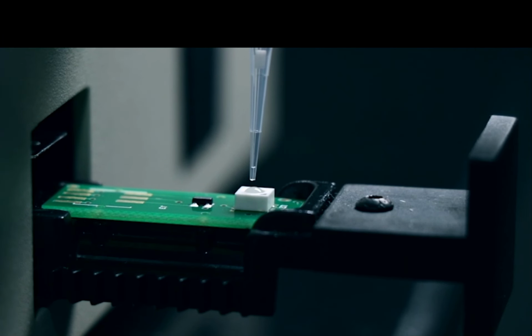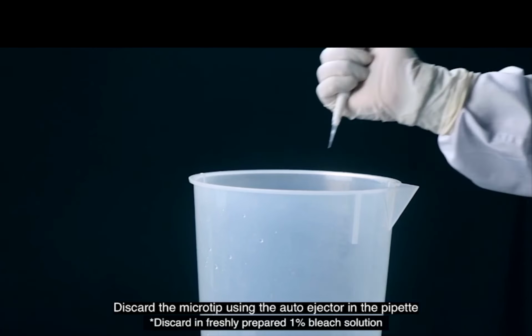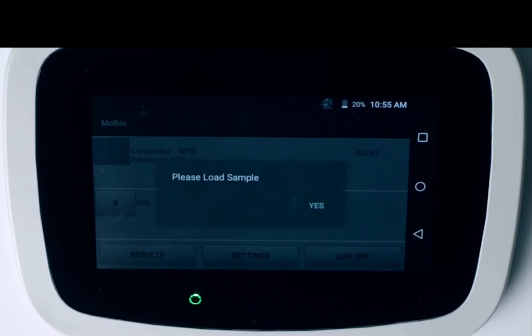So even after the drop is gone, you can see something is left. So please don't try to push it further inside. That one drop is enough for the test. Now you have loaded the chip. Okay, so now only you discard the tip. Two steps of tip are required.